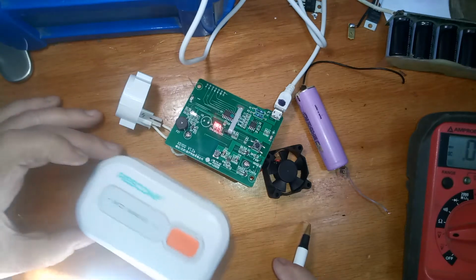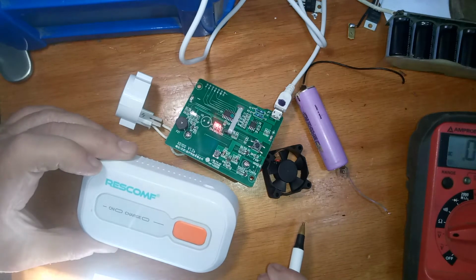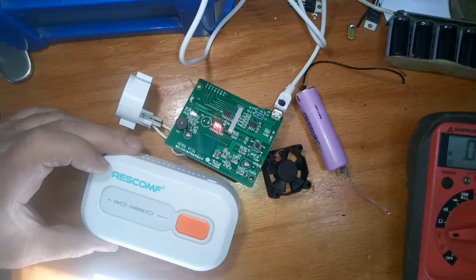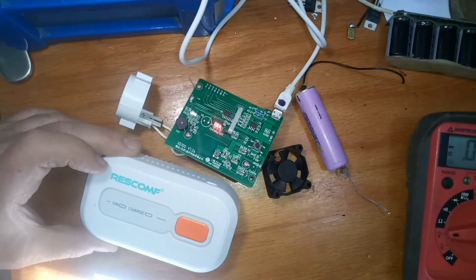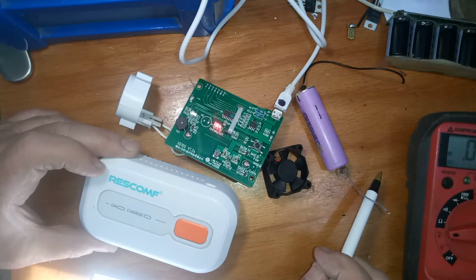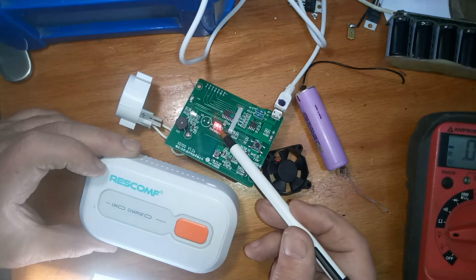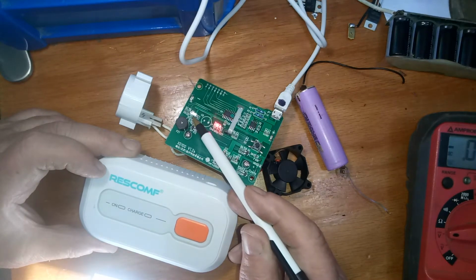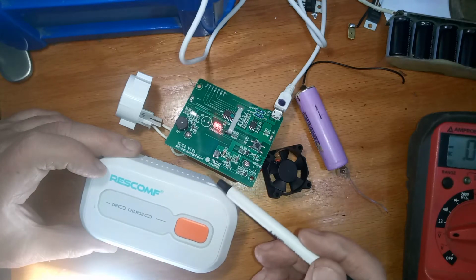I bought this RESCOMF CPAP cleaner on eBay. It was kind of nice for about 3 weeks, and then it stopped working. The problem is that this charge light is supposed to turn green after a while, and it doesn't. And of course, this is the run light, and it never does run.